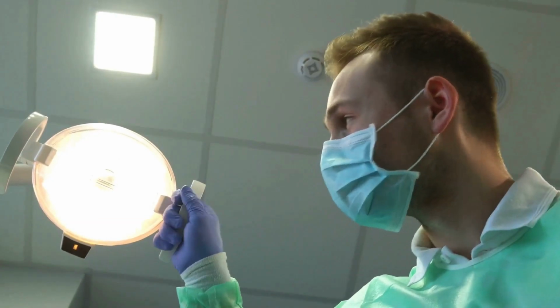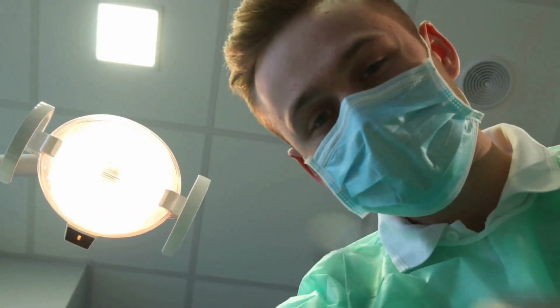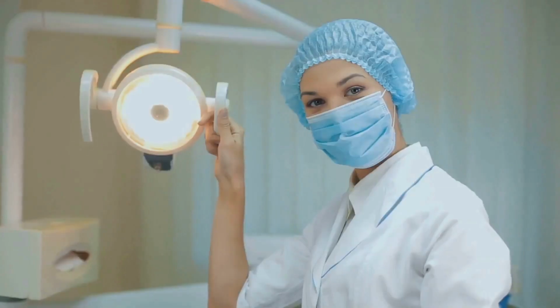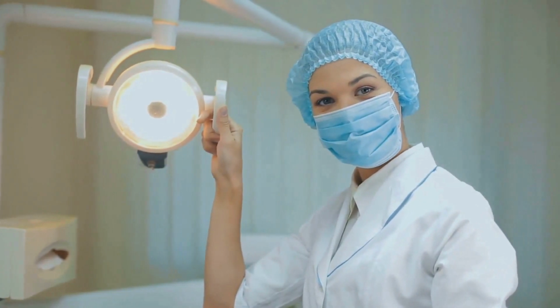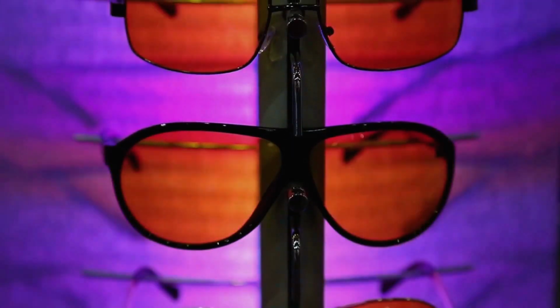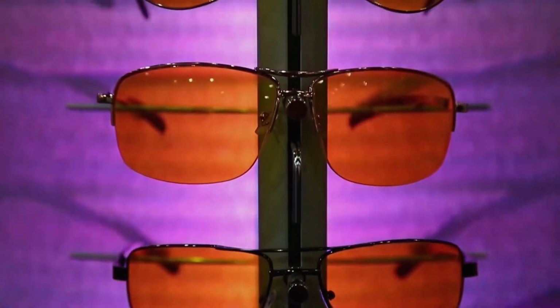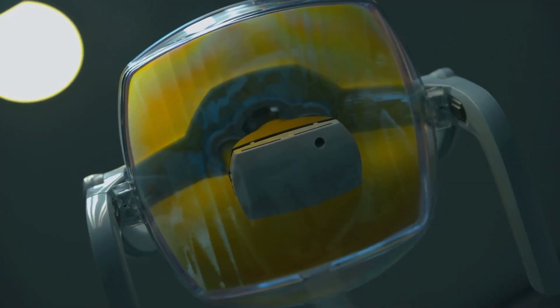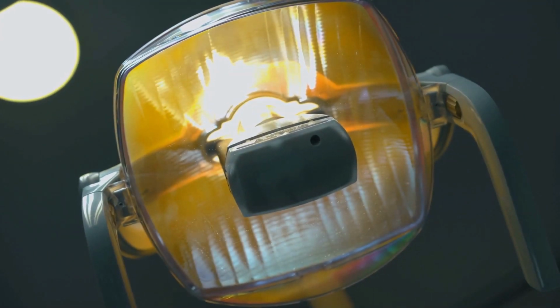Selecting the right polarizing filters is crucial for achieving optimal results in cross-polarized dental photography. While various brands and types of filters are available, certain characteristics are particularly important to consider. Firstly, the filter should be specifically designed for cross-polarization, ensuring that it effectively blocks unwanted reflections without introducing any color cast or distortion.